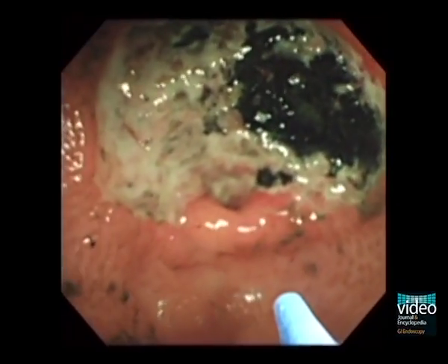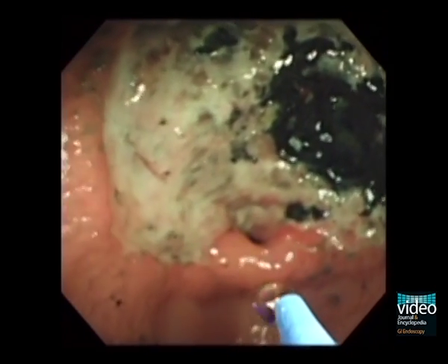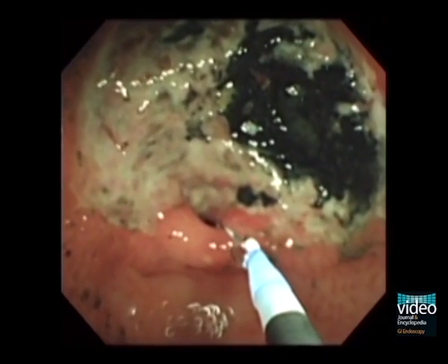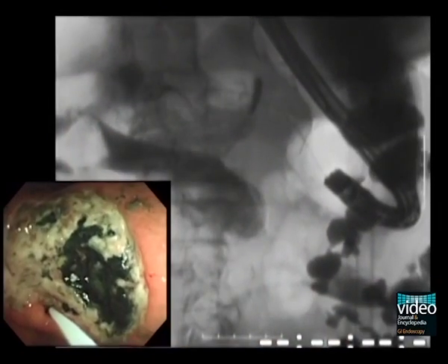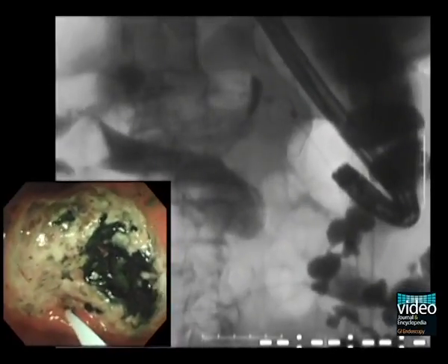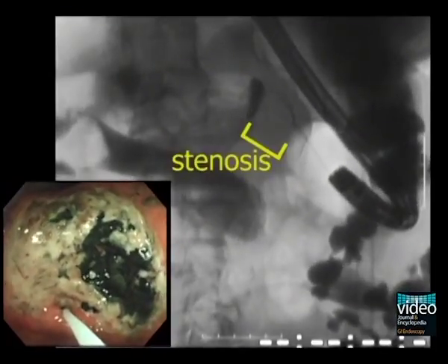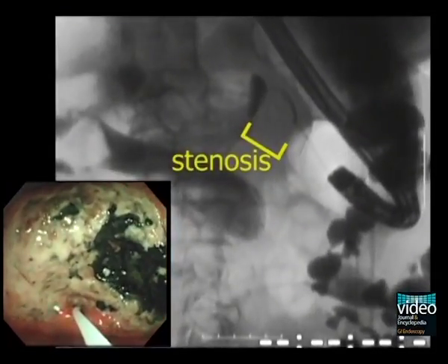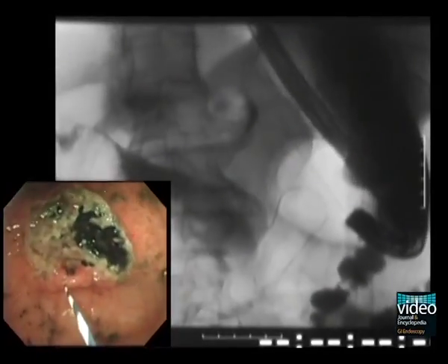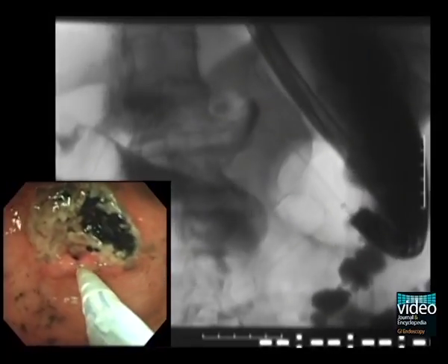Here is an example of pyloric obstruction. This patient is an 89-year-old male with unresectable gastric cancer. A biliary guide wire is introduced across the stenosis. Accurate assessment of the length of the stricture is the key to successful placement of the self-expandable metal stents. The X-ray tube of the C-arm should be appropriately rotated so that a side view of the stenosis can be obtained. A stent of optimal length is then selected based on the length of the stenosis.